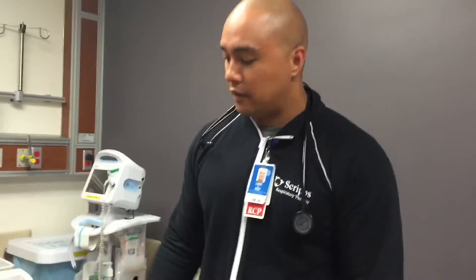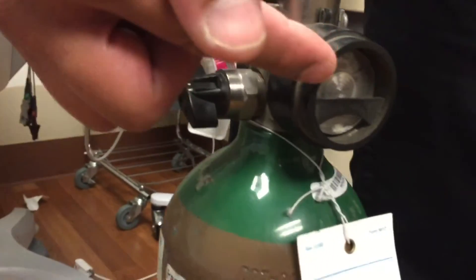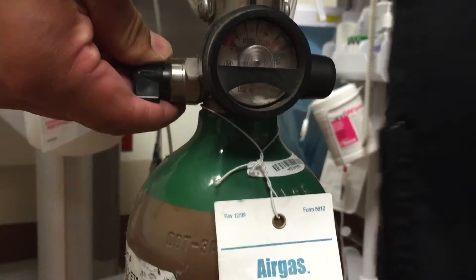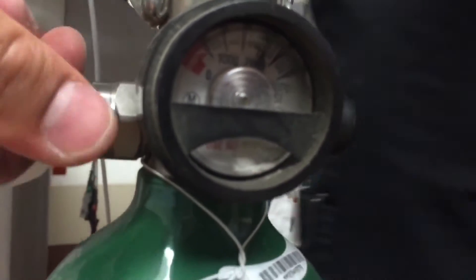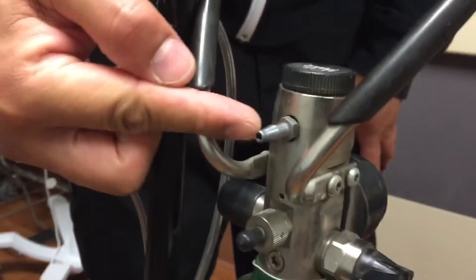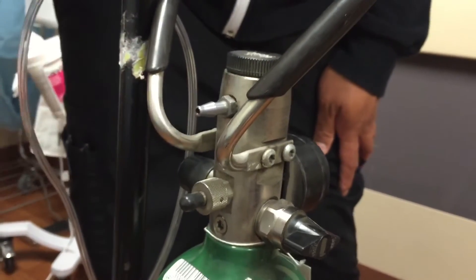Now I'll show you the E-cylinder and how to turn it on and identify different parts on it. What we have here is your regulator. As you can see, your pressure gauge is reading at 0 psi. In order to pressurize the cylinder, we're going to turn on your regulator valve here and you should see your psi levels climb up. And if I turn the cylinder this way, you'll notice a nipple adapter where we can hook up our Circulair aeromed mask.